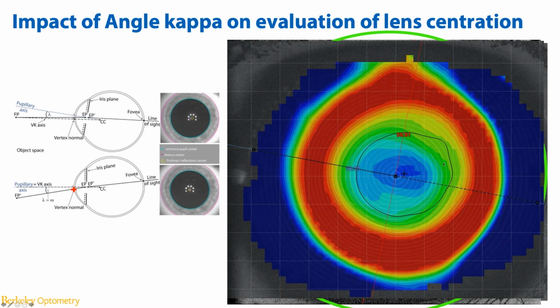So even within this treatment area, we're getting a lot of positive spherical aberration. And also in terms of the paracentral steepening, there are actually at least three components at play. Number one is the amount of paracentral steepening we're seeing, whether this is 2 diopter, 4 diopter, or 8 diopter. Number two is the width of this paracentral steepening.